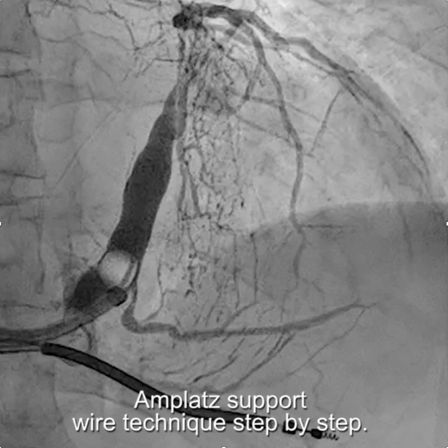This video describes how to use the AMPLAT support wire technique in a step-by-step fashion.